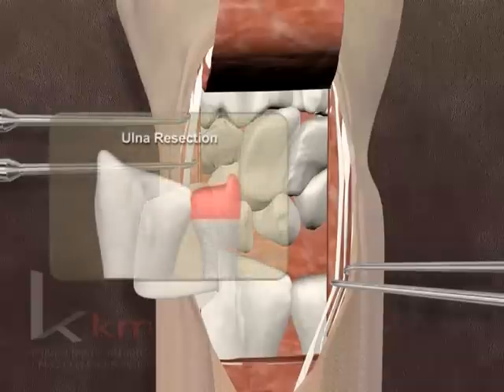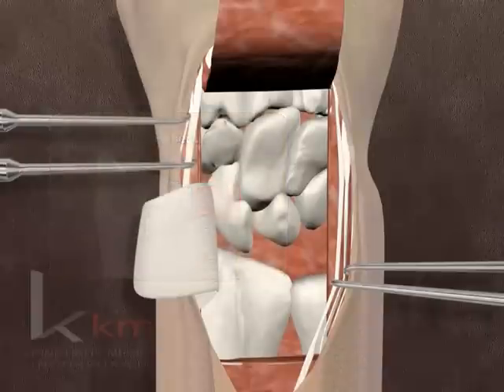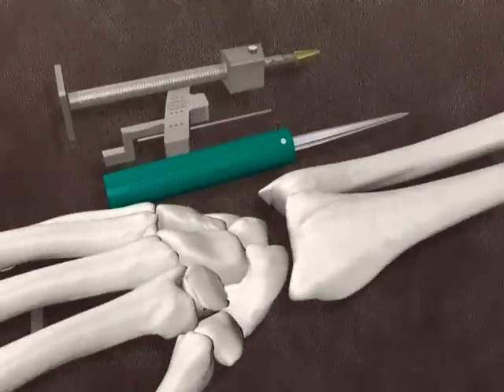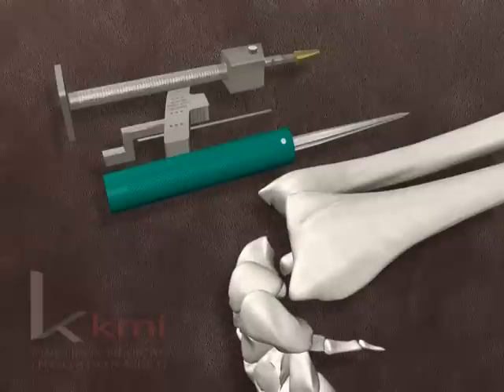If necessary, a resection of the distal ulna is performed at this time. The wrist is fully flexed to expose the joint. Synovectomies of the radiocarpal and distal radial ulnar joints are performed when needed.